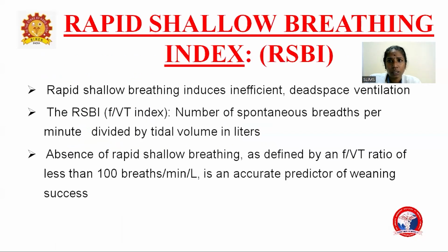Moving on to the rapid shallow breathing index. This is an important criterion for extubation, that is, weaning. Rapid shallow breathing induces inefficient dead space ventilation.